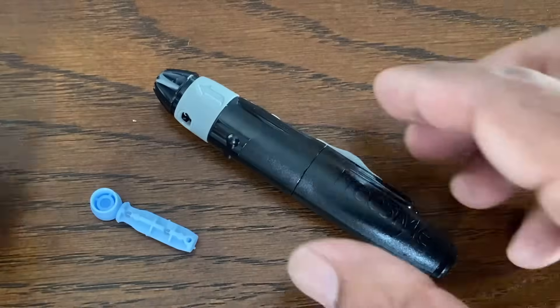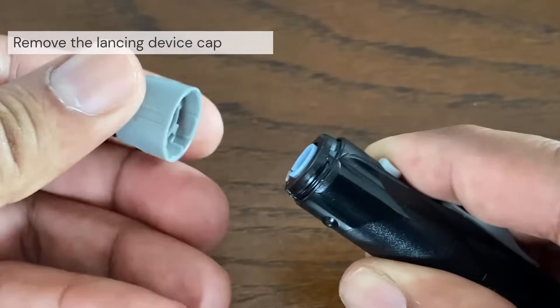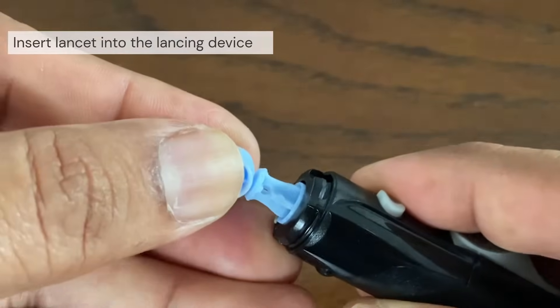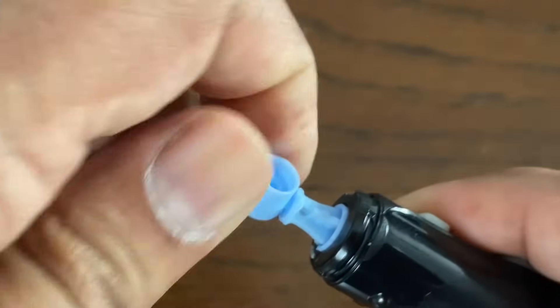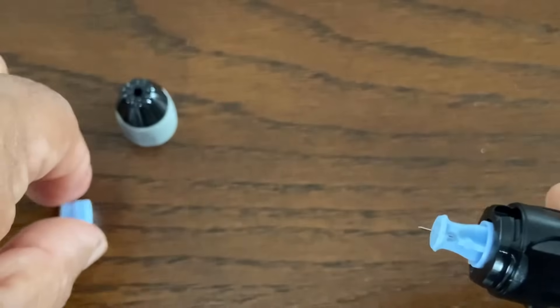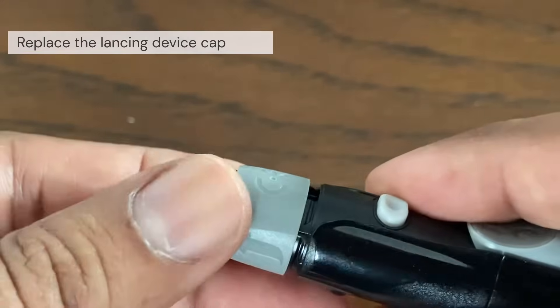The first step is to get the lancing device ready. Remove the cap by snapping it off at an angle. Next, insert a sterile lancet into the lancing device and push it in until it snaps into place. Twist the protective disc until it separates from the lancet, and save this protective disc as it will be needed later. Replace the lancing device cap and gently push until it snaps or clicks into place.